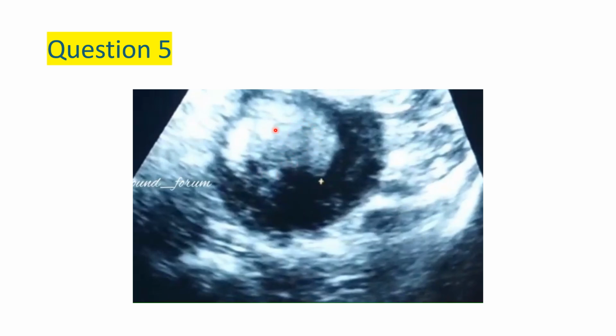So this echogenic mass, ladies and gentlemen, is in keeping with a lipoleiomyoma. So it's a fibroid that is deriving from fat. So it's called a lipoleiomyoma. It is the one that is echogenic, or that has got the configuration that looks like this.